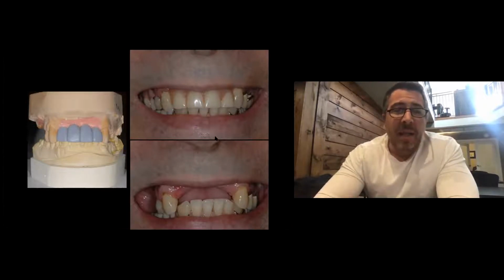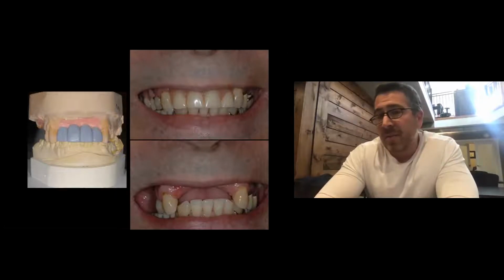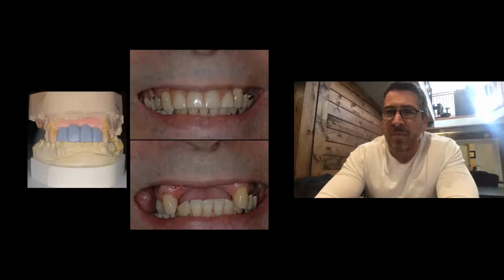Now, there was a little lack of communication in the case, and partly my fault, partly the patient's fault, partly the surgeon's fault. We all just were not on the same page with it. And the patient's primary concern was this reverse smile. So he really, really wanted to have this denture gone with implants, but he wasn't really wanting any incorporation of pink into the prosthetic at all.